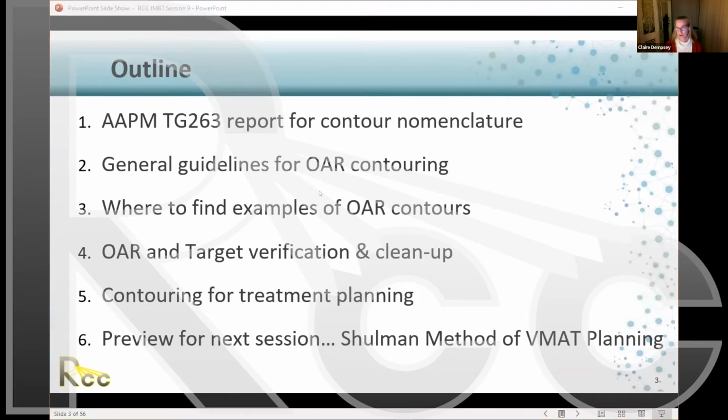There are a few different websites you can go to for references and to get some practice in. We'll look at organ at risk and target verification and cleaning up contours, and then more specifically contours that we create specifically for treatment planning. Then I'll quickly highlight what's going to happen with your presentation next week, when we look at a specific method for planning VMAT treatments.